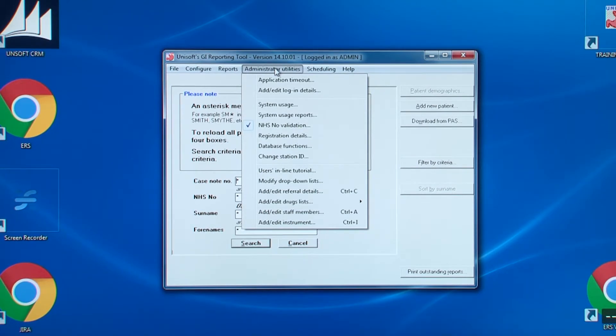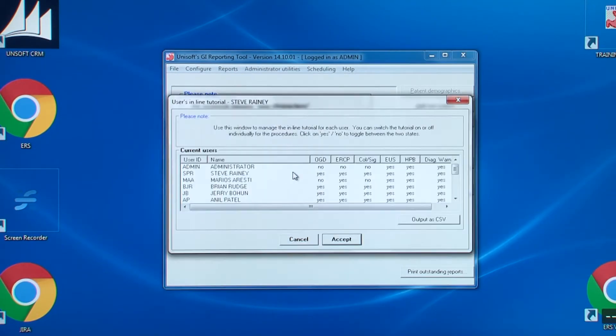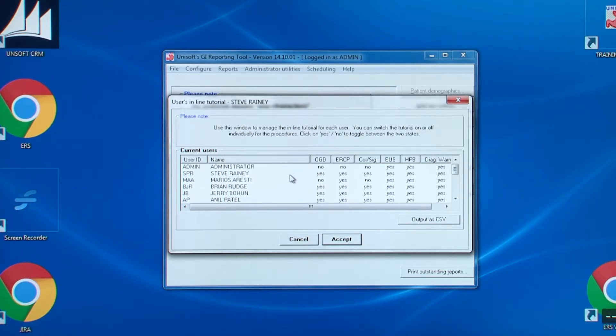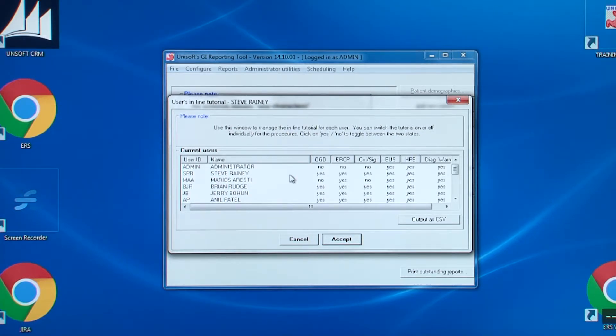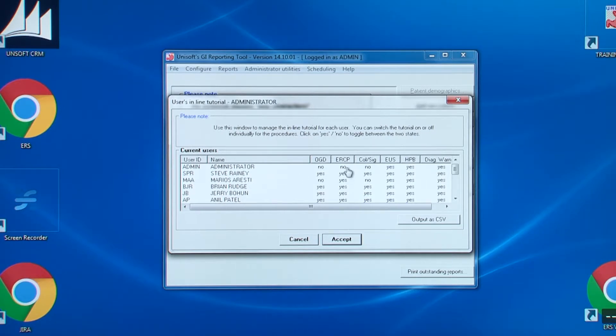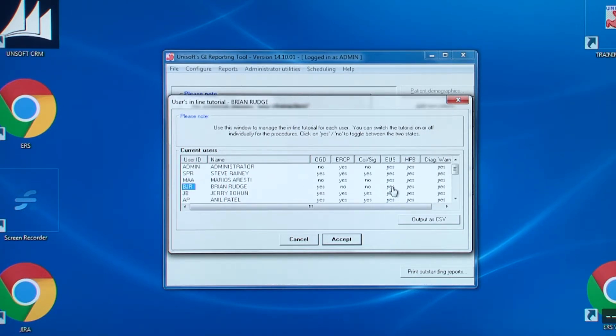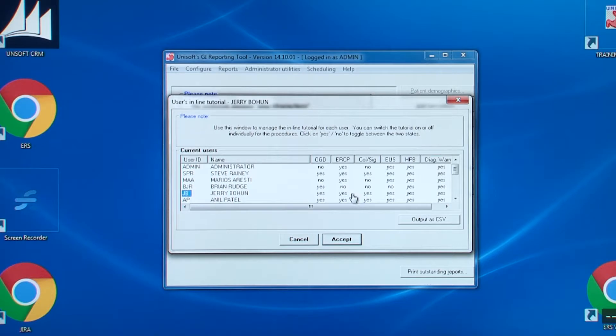Now, we come down to the other important entries. The first of these is the inline tutorial. These are the red instruction windows that appear when endoscopists enter reports. After a while, these will become unnecessary and can be switched off for the user and for particular procedures. Again, you can click the headings of the columns to switch them into alphabetical order. Just point and click to switch a yes to a no and vice versa.